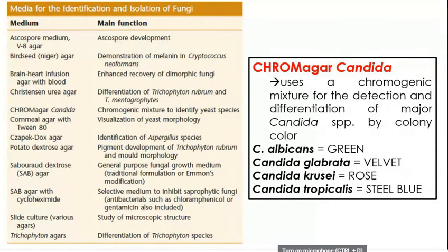Chrome agar candida is specifically for Candida. So, konti lang naman yung aaralin nyo. Basta alam nyo kung ano yung mga media na ginagamit pag fungi na ang pinag-uusapan.